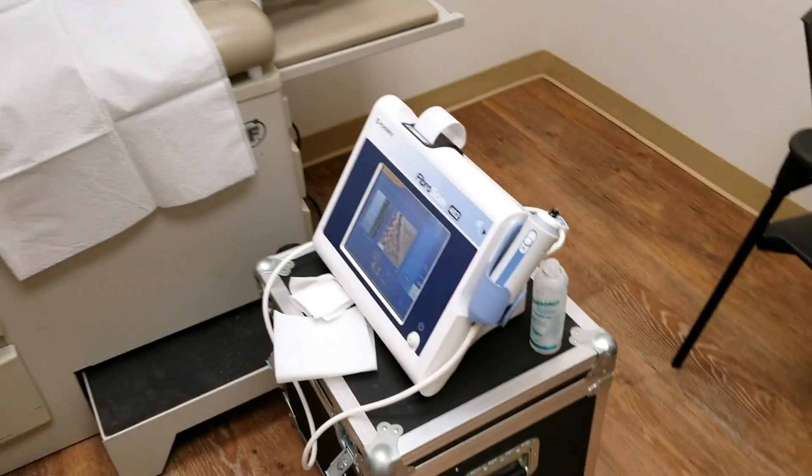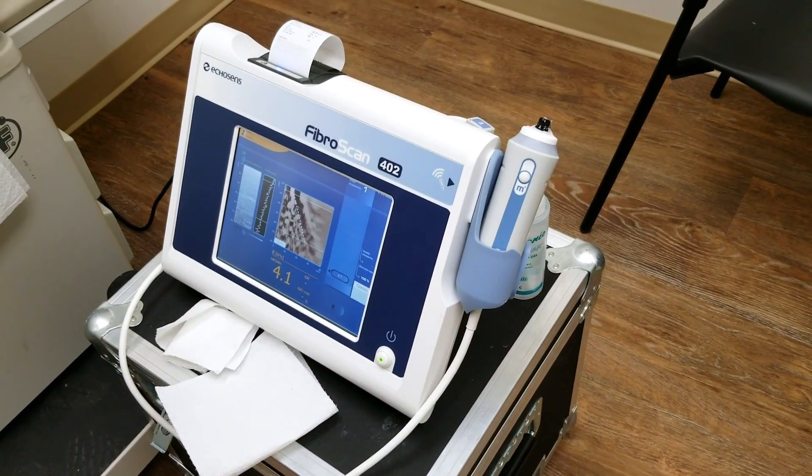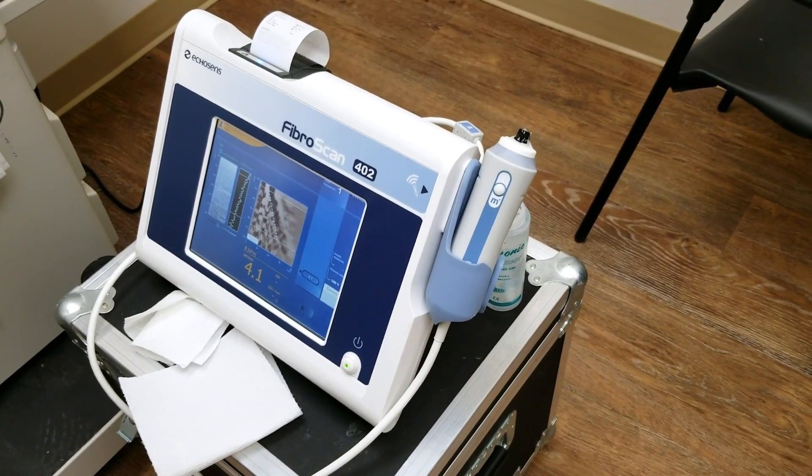Over here you'll see the actual FibroScan machine. There are different types of FibroScan machines, but the test itself and how it's carried out for patients are all the same.